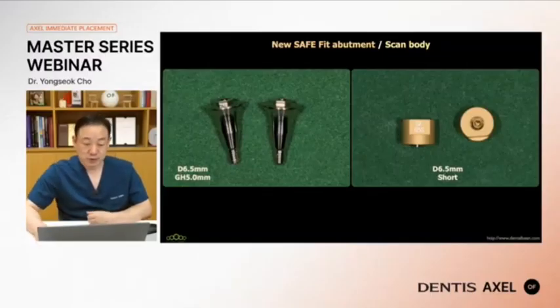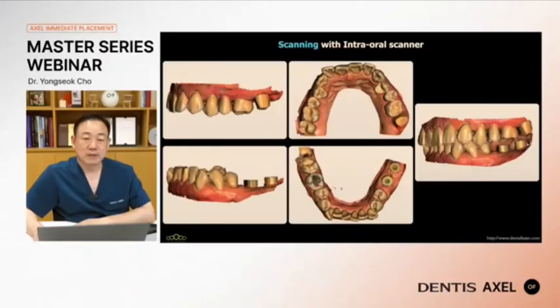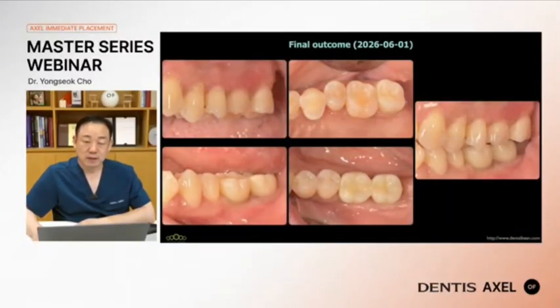Here, new safe fit abutment was connected and scanned the implant. Then with a digital process, definitive restoration was fabricated. Then delivered to a patient.